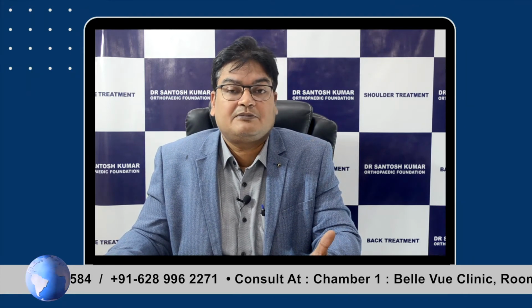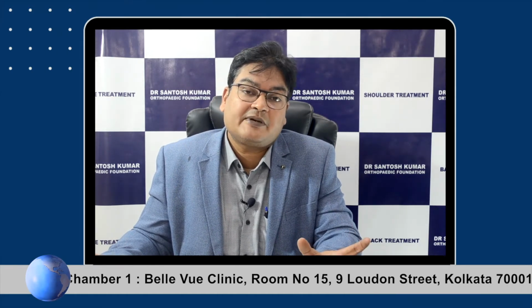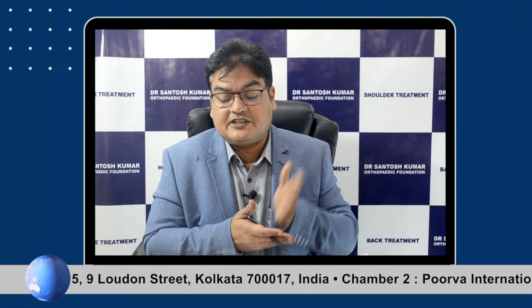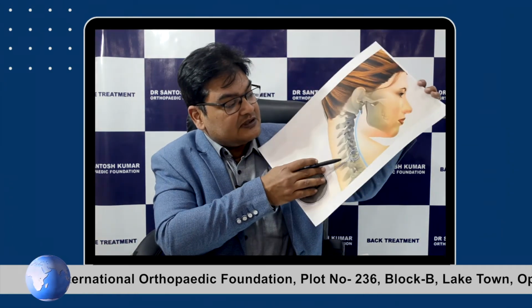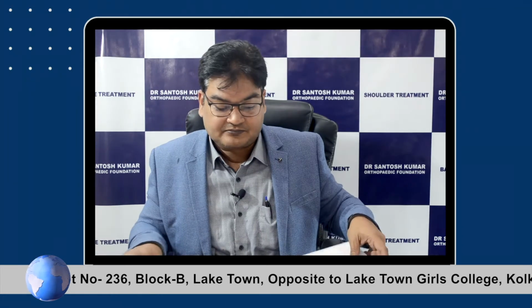Of course, the person will be able to move his or her neck because the movement takes place around 10 to 12 segments. So if only 2 or 3 segments are fused, movement will still take place, but it does restrict the movement. So wherever possible, we go ahead with something called cervical disc arthroplasty. What it means is that we replace the disc with an artificial disc. So this is what is known as cervical disc replacement or cervical disc arthroplasty.